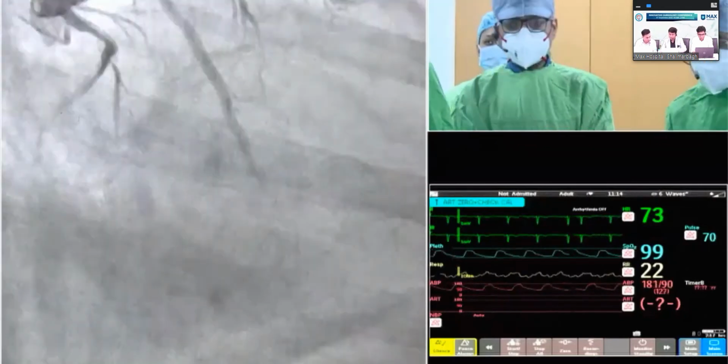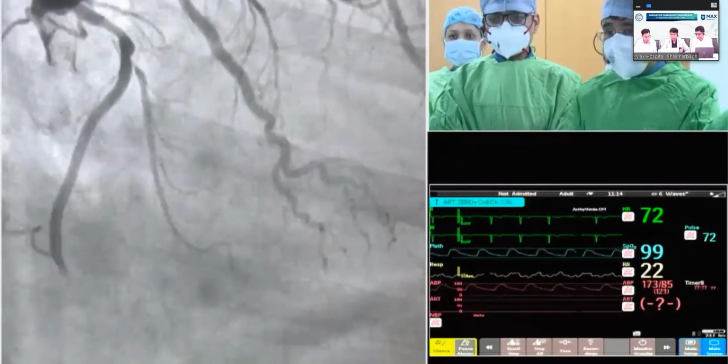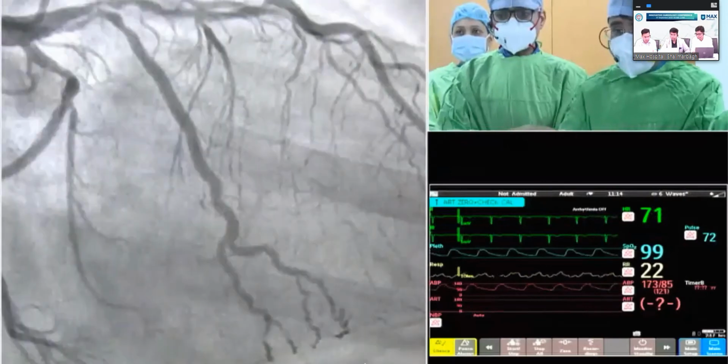Yes, you are absolutely right, Devinder. So our strategy would be like this, because he is absolutely right that you cannot pass an imaging catheter through this tight lesion.